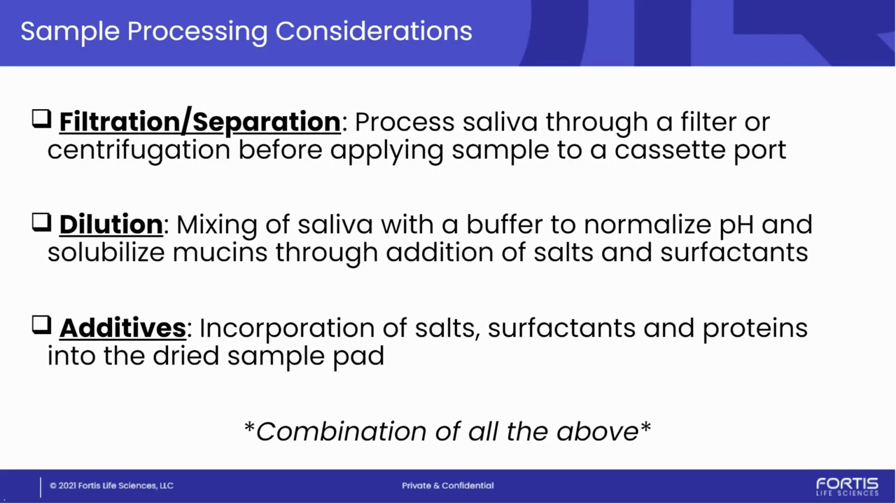It's going to cause some really significant issues when it comes to viscosity and sample flow. That's why we recommend, for quantitative tests, we don't have the ability to handle some variations in sample consistency, like a qualitative test may. For quantitative, that sample has to be consistent every time. So we do recommend using a swab that allows some filtration ahead of time. And that might not be the only filtration you have. It could be filtration with the swab that goes into another, say, mesh filter that's built into the cassette to extract that liquid phase. So that's something to consider.